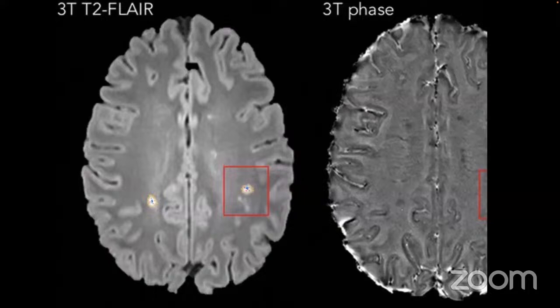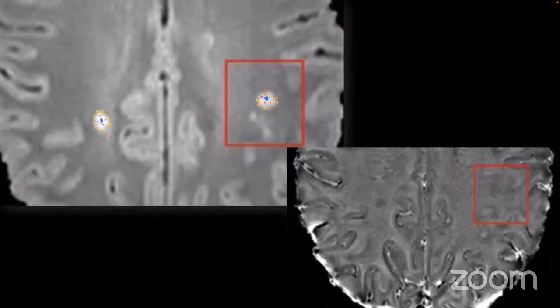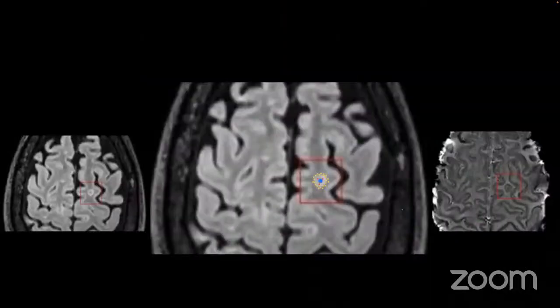And I think it is very soon to be announced as one of the diagnostic signs for multiple sclerosis, in the sign called paramagnetic rim. Paramagnetic means hypointensity in SWI, and rim because they are usually, so this is the same lesion but in a closer look, so you start to develop some hypointensity in all the lesions that transform into a chronic form, and it can be really in a typical nice ring form like this lesion as well.